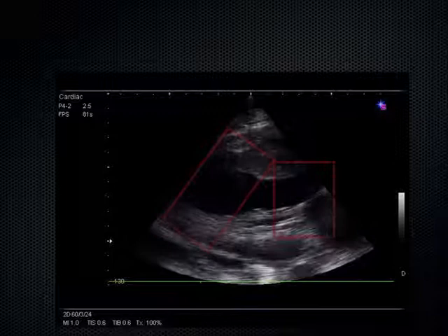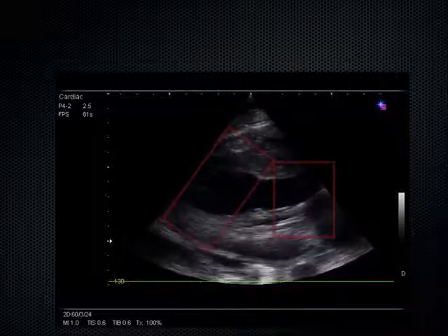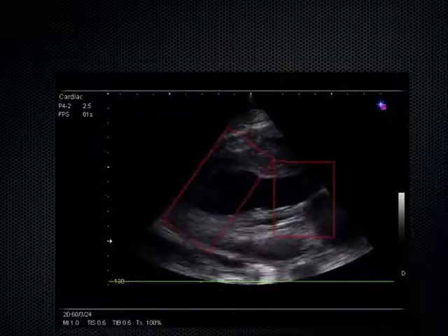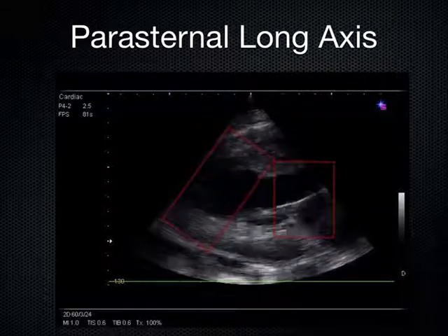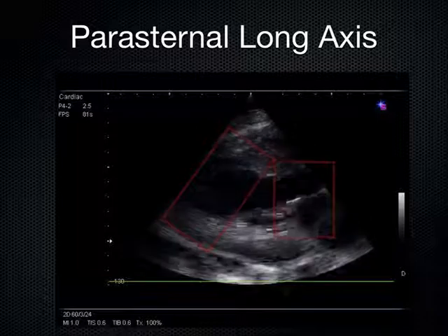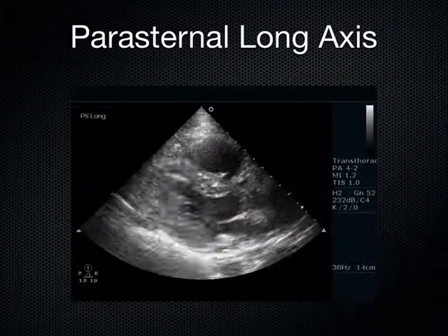Because when the nurse comes to you and says, hey, this patient's hypotensive, we've got to resuscitate this guy, how much fluid should I give him? That's their first question to you. So you just have to be very careful that you don't just start dumping fluids into a heart that looks like this. That's why, with anybody who's hypotensive, I immediately go to the bedside and take a look at their heart, and then I make a decision about whether or not to give fluids at that point.